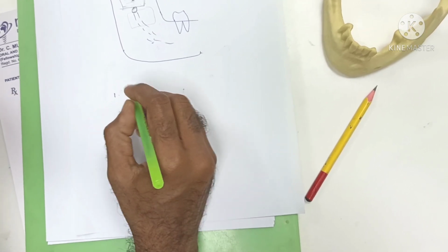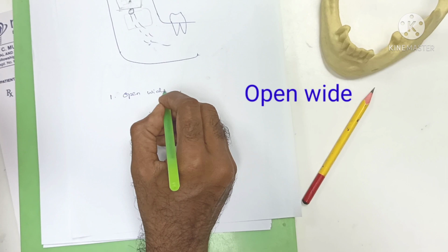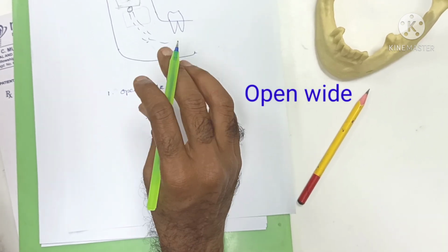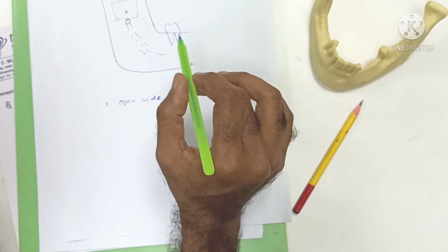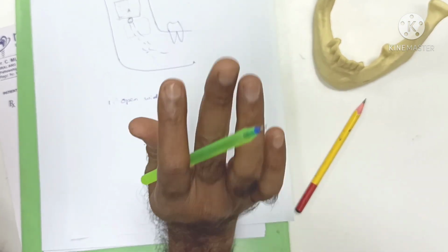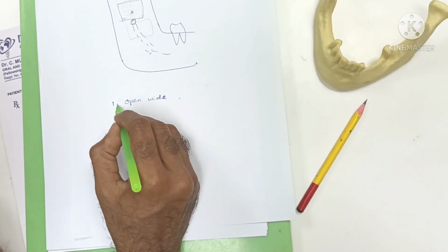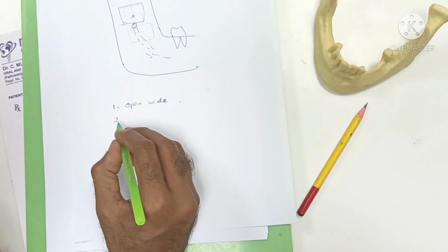So first thing is, ask the patient to open wide. Only if the patient is opening the mandible wide, we can target this area properly. If the patient is partially opened or not fully opening, then failures will happen. So this is the first thing, we have to make sure the patient opens wide, then only the block will work properly.